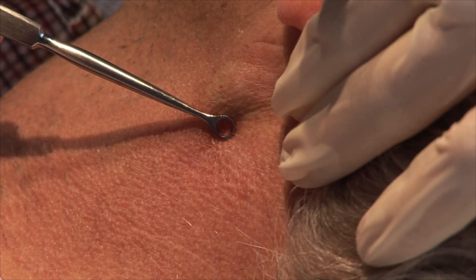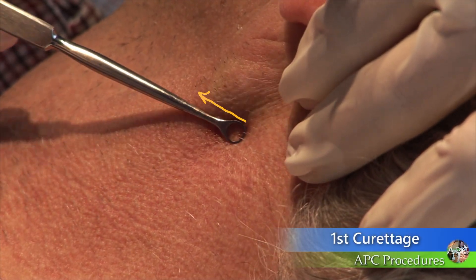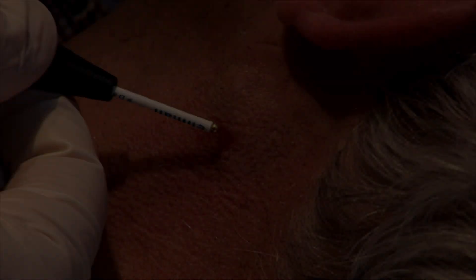Use the curette to scrape the lesion from the skin surface down to the dermal layer. As curettage is performed, the operator should be able to sense the softness of the basal cell cancer in contrast to the normal dermal layer.